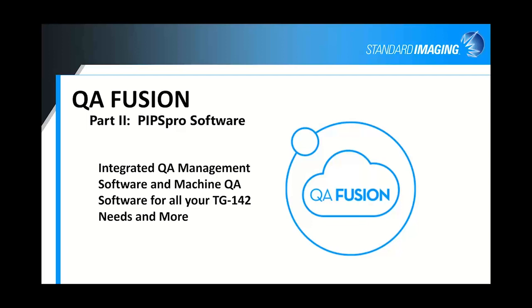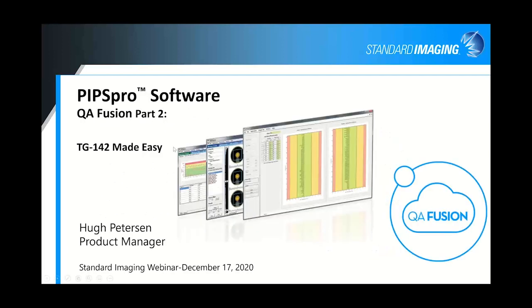So today, like I said, I'm going to cover the PIPSpro component of it, if I can get my PowerPoint to move forward. Seems to not want to move. There we go. Sorry about that.